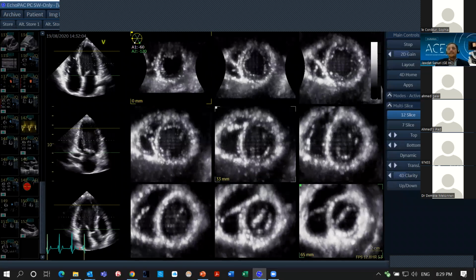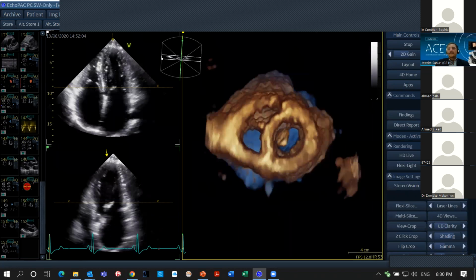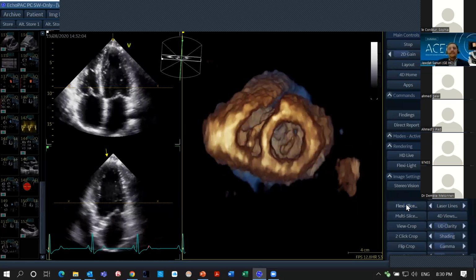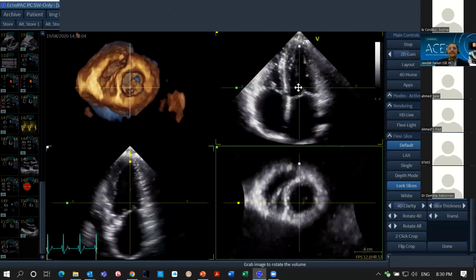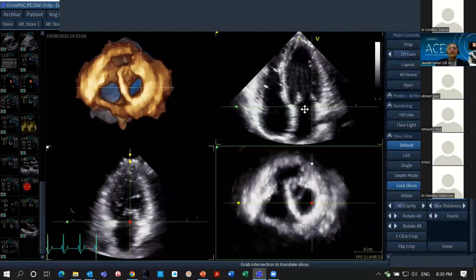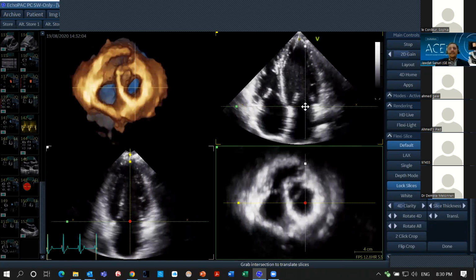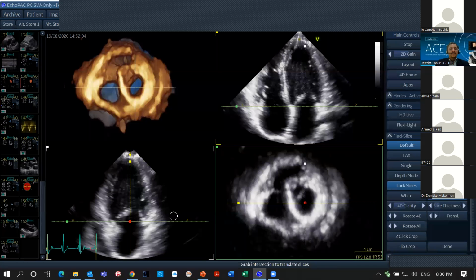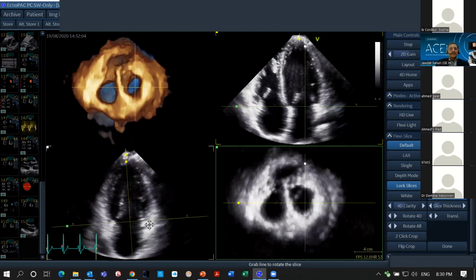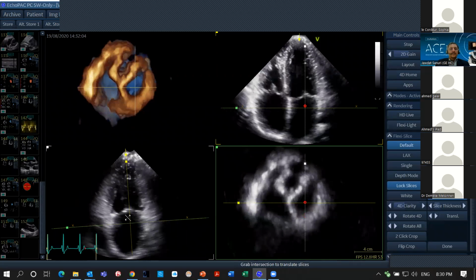But if I'm using the MVQ method, which gives you automated anterior leaflet length, tenting height, many things, including the mitral annulus area, the annulus area number will usually be odd. The number is not going with the usual method. It will not be reasonable. It will be like 10, more than 10. So it's not appropriate always. I don't know why this method is not accurate for assessment of the annulus area, which I need many times.